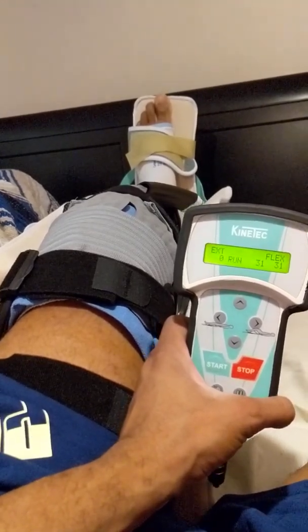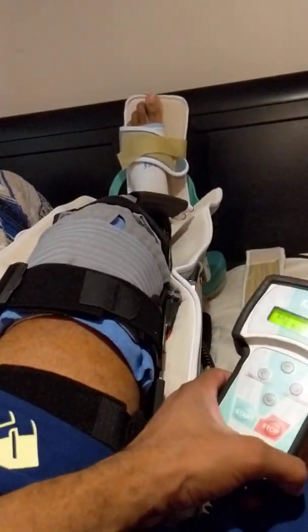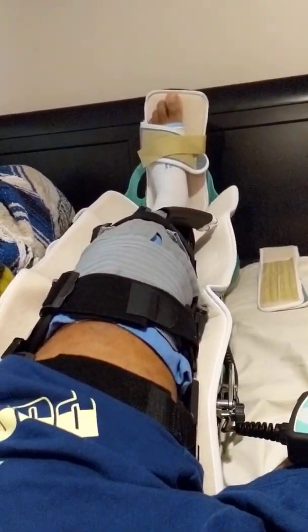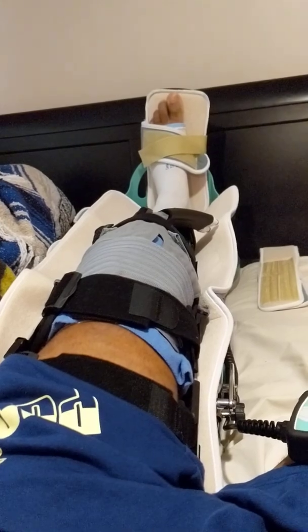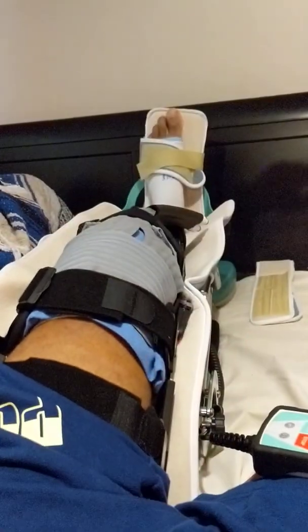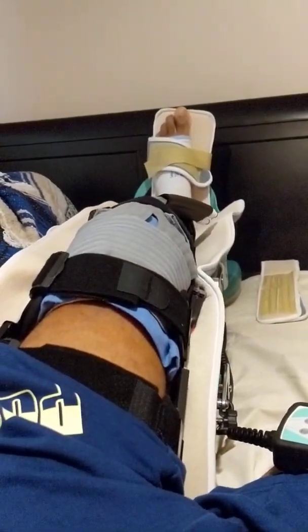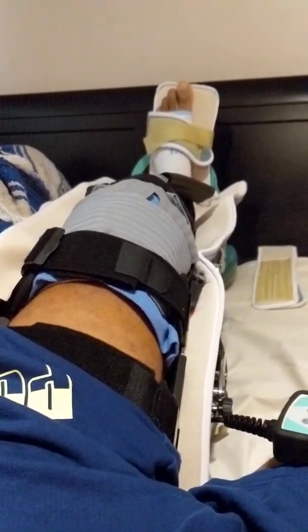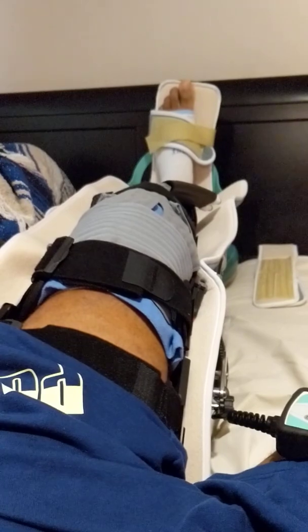They want me to increase 5 to 10 degrees every day. Our goal for the end of the week is 90 degrees flexion. 90 degrees would be like this — that's 90 degrees. So basically, this machine is called CPM — continuous passive motion.